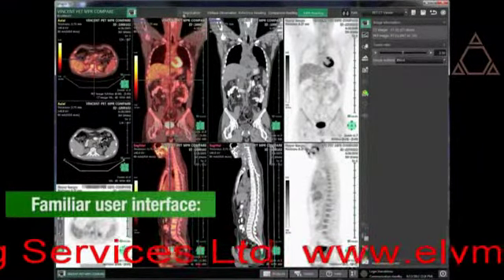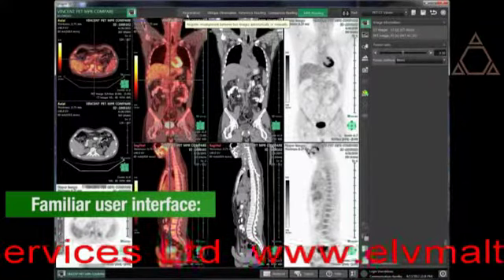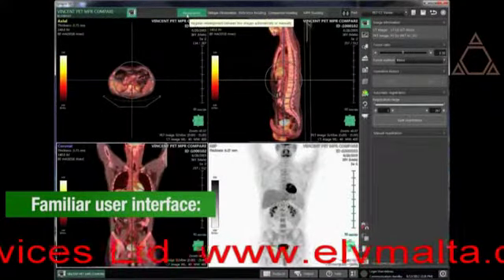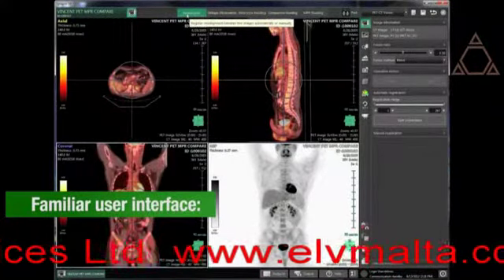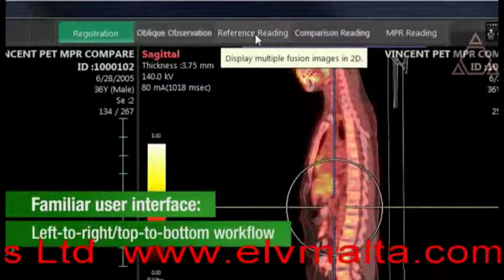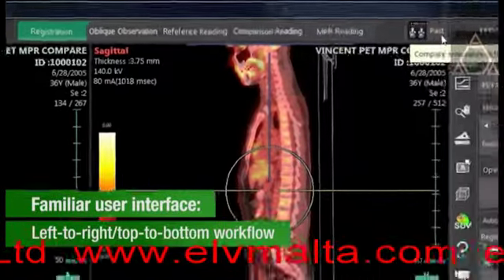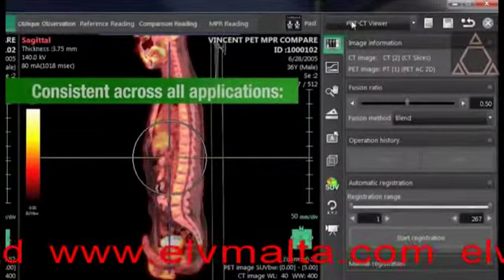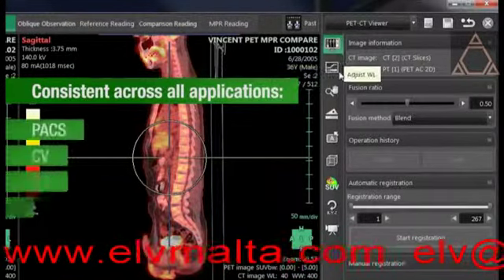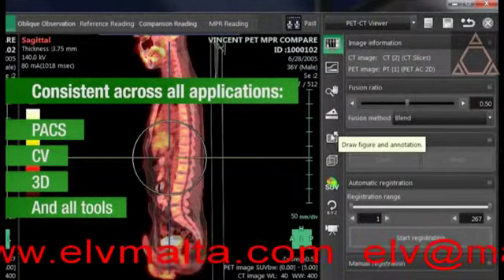The Synapse 3D user interface was designed to be familiar to Synapse PACS and cardiovascular users. The left-to-right, top-to-bottom workflow is consistent across all Synapse applications, as well as all of Synapse 3D's tools.